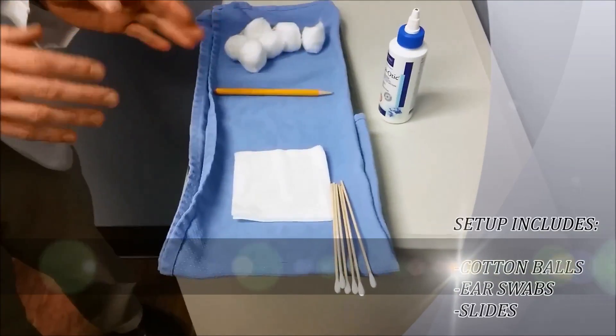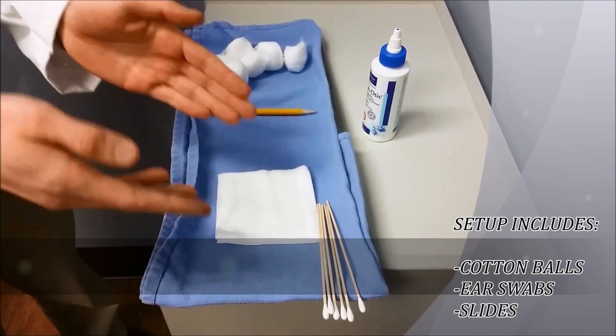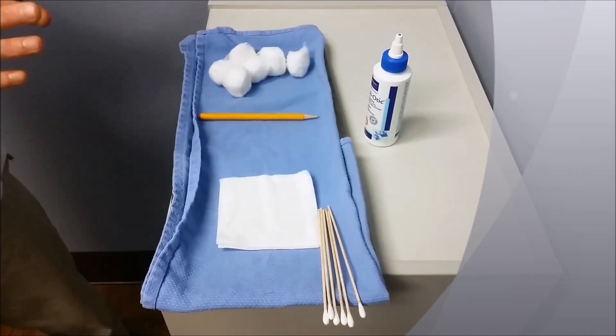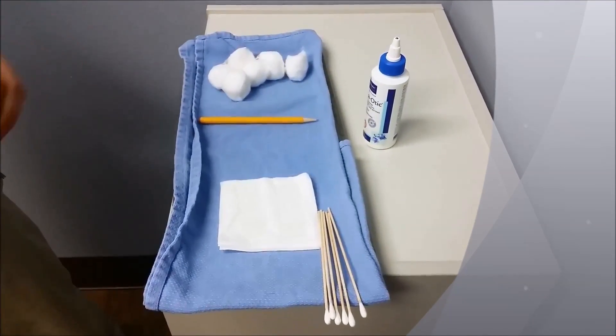So there's a few things out. I've got my slides and I have my clean ear Q-tips, and then the rest of the stuff we'll do later for a different video that's on ear cleaning.